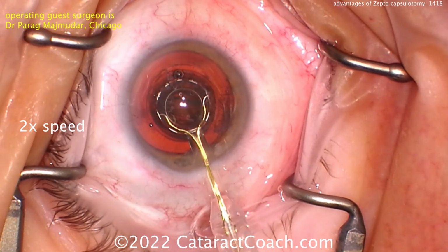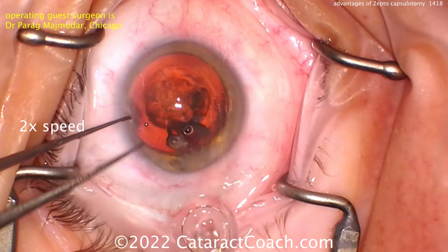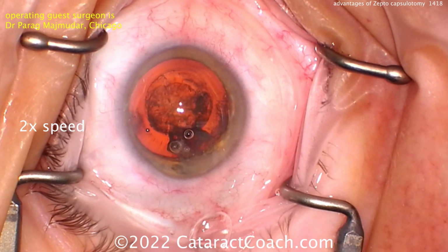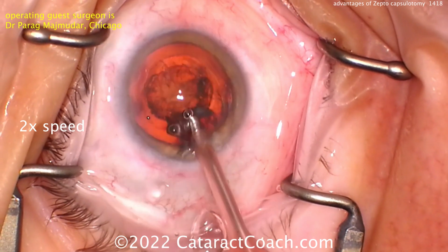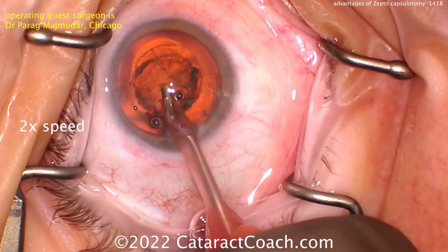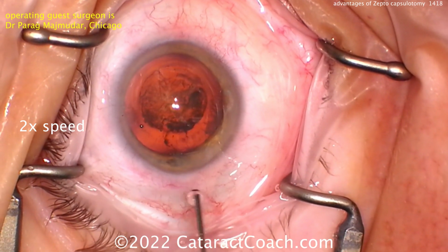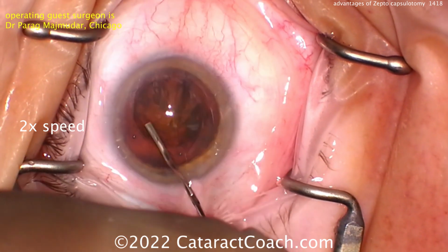You know it's fantastic for a case of an intumescent white cataract, but it's also very good for a routine case. So you can see you get that rhexis that's centered up on the visual axis. Look at the Purkinje images, and you can see where the rhexis is, or the capsulotomy, and it's beautifully centered. And so at this point, now you can do your hydrodissection and proceed normally.